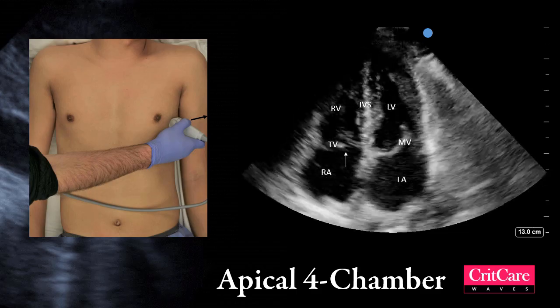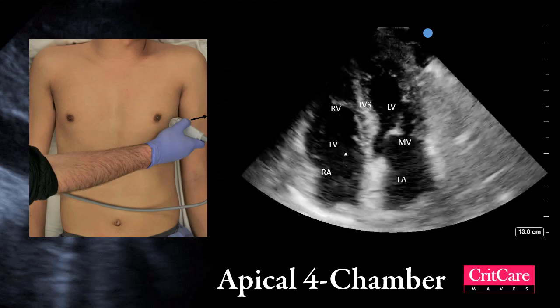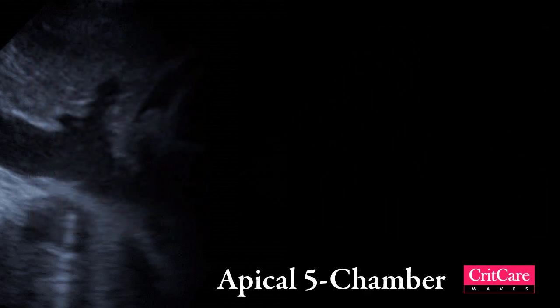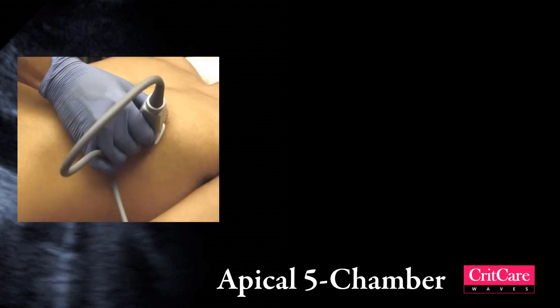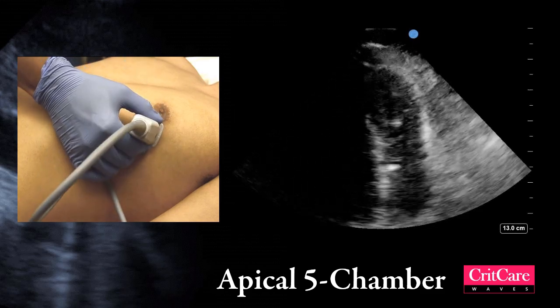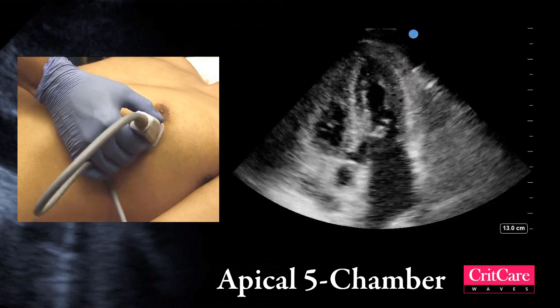The next view obtained in the apical region is the apical 5-chamber view. This view is important as it is used to calculate stroke volume and cardiac output in the ICU setting, which will be discussed in a separate video. To obtain the 5-chamber view, start by obtaining the 4-chamber view and slowly plane the probe anteriorly as shown in the video.